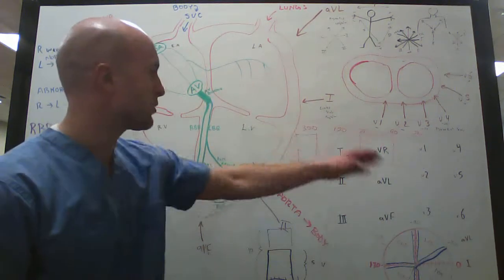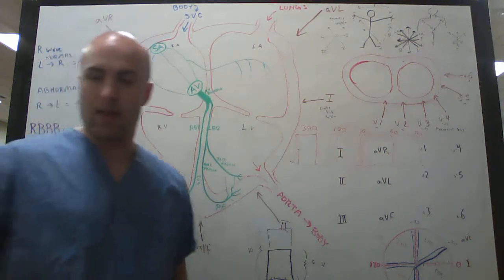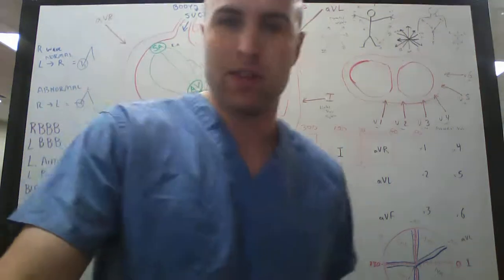And so you can see how many beats per minute by just counting how many boxes apart the peaks are. That's the first part of this. I'll continue this.